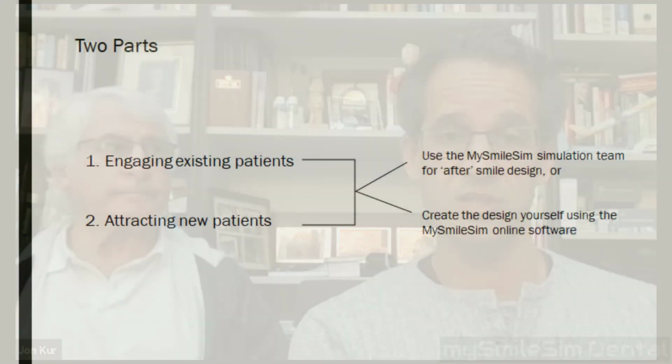You then have the option of either sending them to the patient with a note. Some practices put quite a personalized note with each one, or you can set up standard messages that go out. Or you could put a note back to us to say, I like that, but it needs to be bigger, moved around, a different color, whatever sort of designs you want to let us know. We'll do further simulations based on those directions, and then the process just repeats. If you like those, you can send them to the patient, otherwise send it back to us.